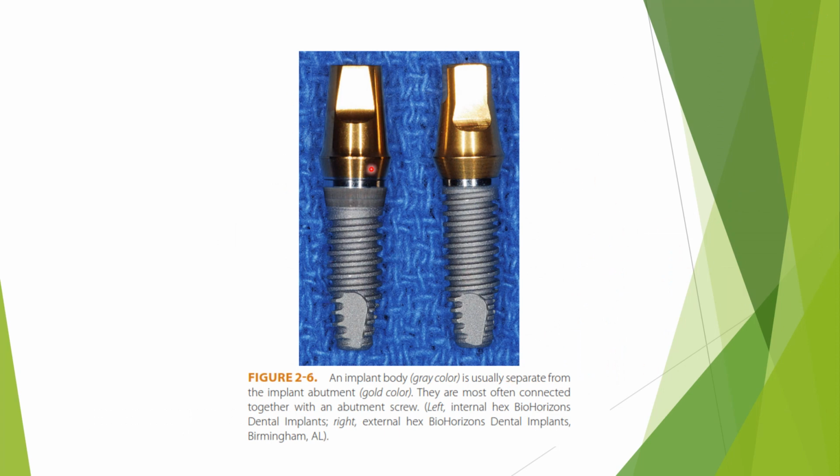So here this is the implant body, which is usually separate from the implant abutment and most often connected together with abutment screw. So this is the internal hex connection and this is the external hex implants.